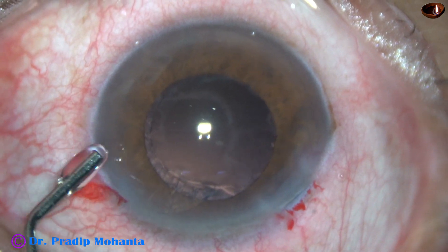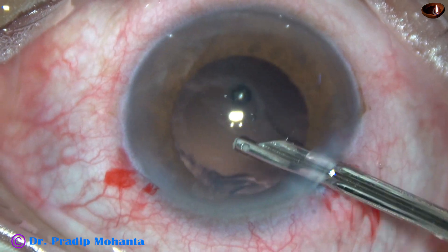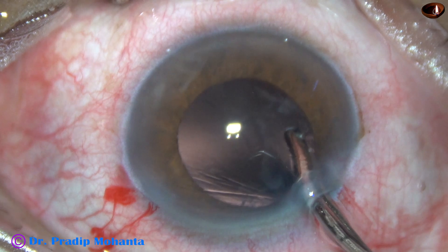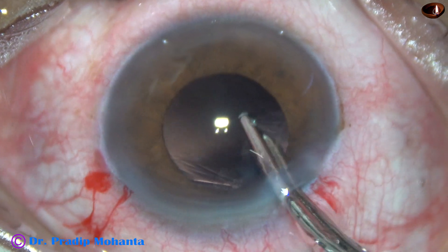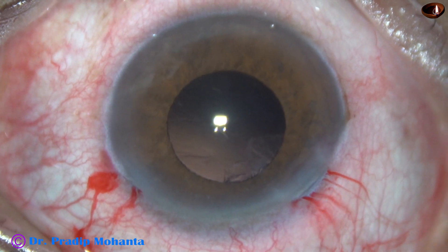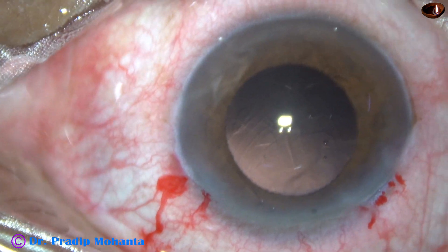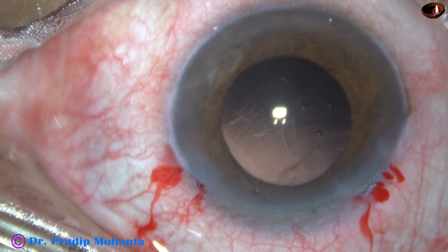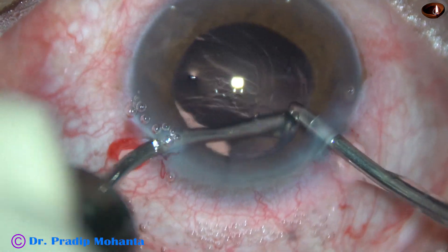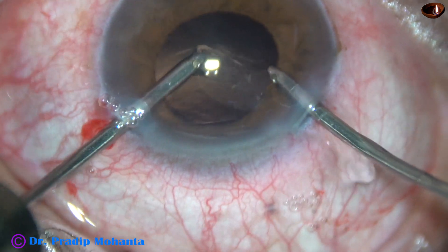Now I inject VISCO to fill the anterior chamber and the capsular bag. I am going to use a 22-gauge Simcoe cannula to remove the cortex all around. The sideport is too small for the Simcoe, but there is some sub-incisional cortex. So I inject VISCO to fill the anterior chamber and capsular bag, then use irrigation through the main wound. Since there is VISCO, it will come out slowly and the anterior chamber will be maintained while I remove this cortex.